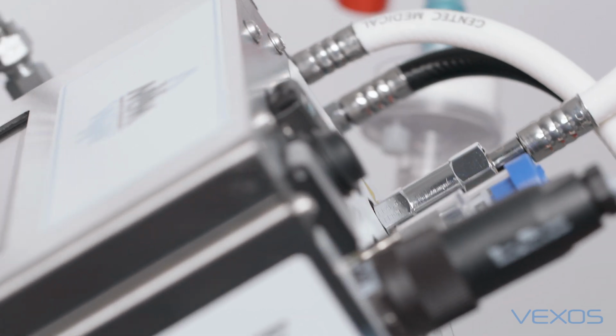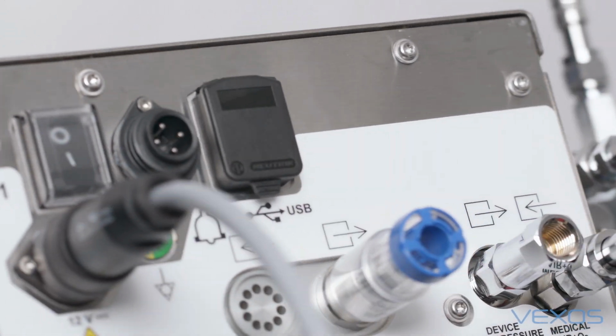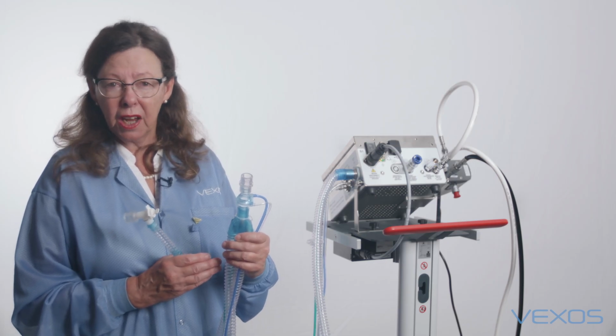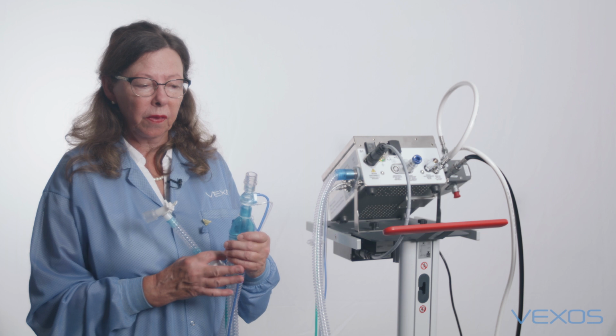The ventilator has been attached to the pneumatic sources, the electrical sources, and the circuit has been assembled and attached correctly to the ventilator. We're about to start the startup procedure. Before doing that, it's vitally important that this part of the circuit is removed so the circuit is completely open for 0 calibration to be able to take place. Also important is that there is no patient attached for these procedures.